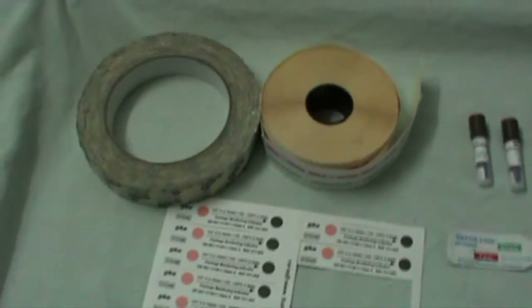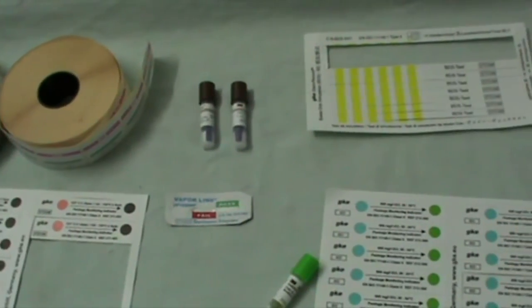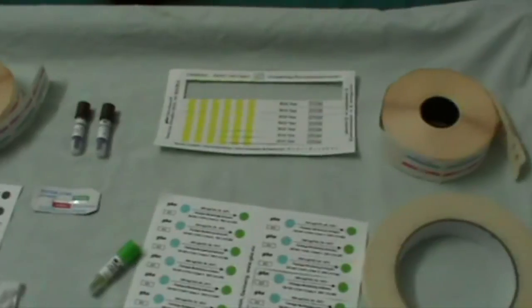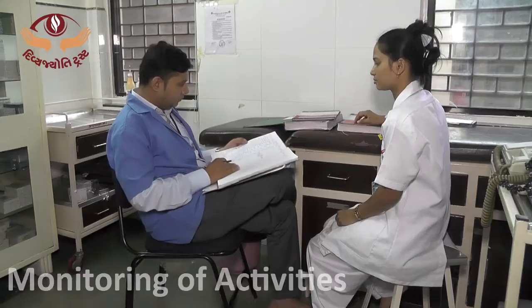Biological monitoring. Biological indicator ampoules are to be put in the load along with other items, generally done once in a week. Frequency can be adjusted as per the workload of the hospital. The autoclaving person should not be aware of its use.